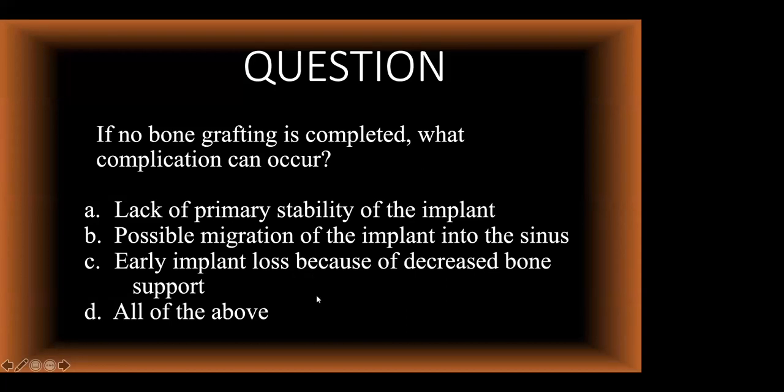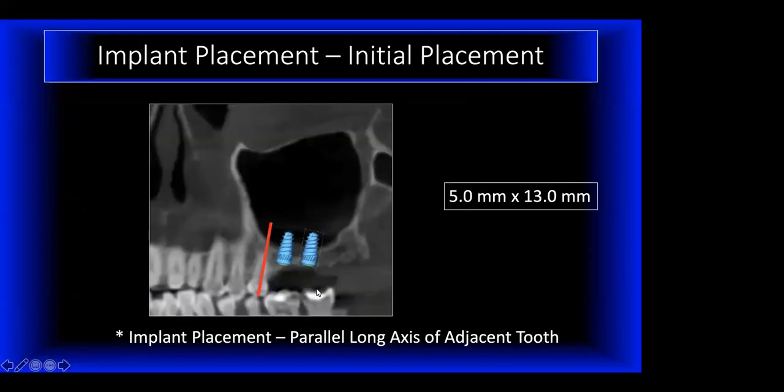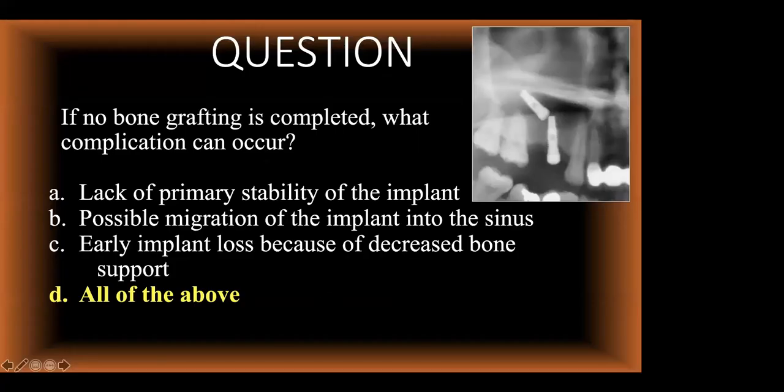And the poll, all of the above, 93%. Perfect. Excellent. So when we look at this, why is it all the above? Because again, always remember, we need that cortical bone. We don't have it. So you must under prep it. You have to use a different surgery technique. Also, we teach a different prosthetic technique.